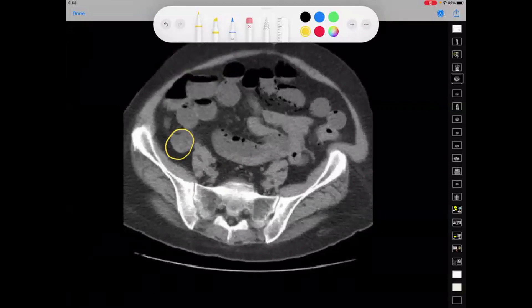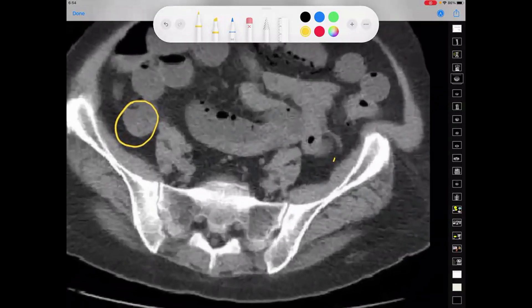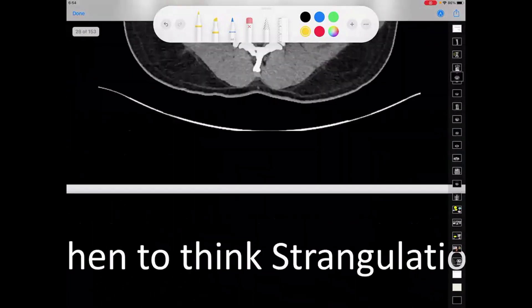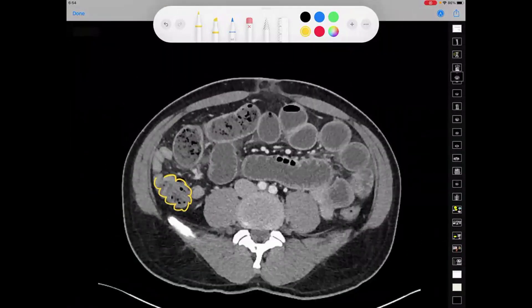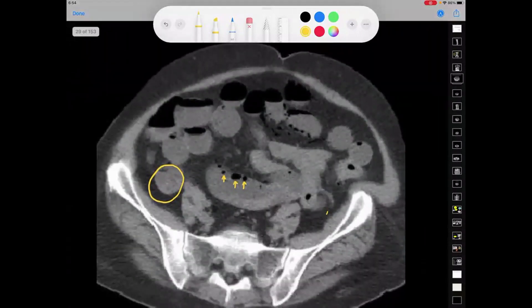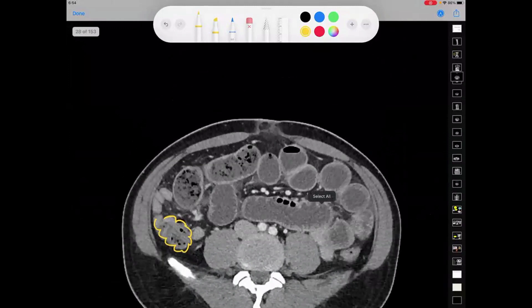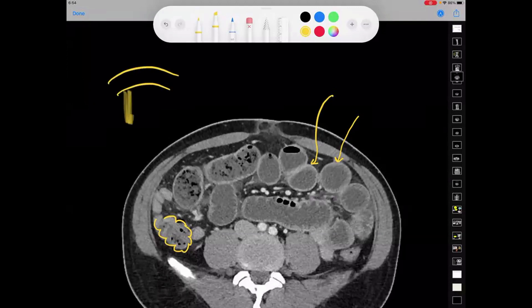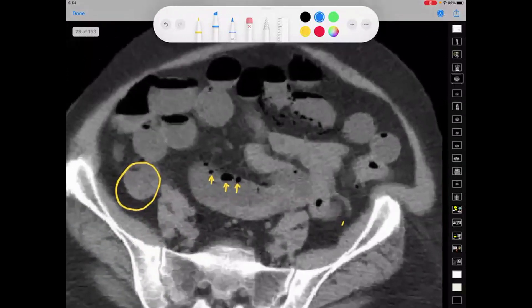This is the right colon and I cannot see the left colon very well in this picture. These are the two iliac blades. Out of the multiple loops of bowel — this loop, this loop, this loop — can you tell me the difference in the look of the intestine in these two images? Number one: can you see that the wall is enhancing? That means it is taking up the dye. So if this is the intestine and this is the mesentery, the basic point is that it is taking up the dye.